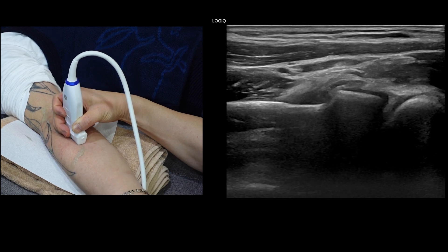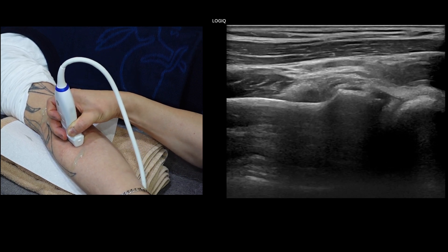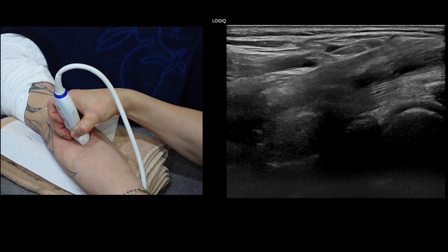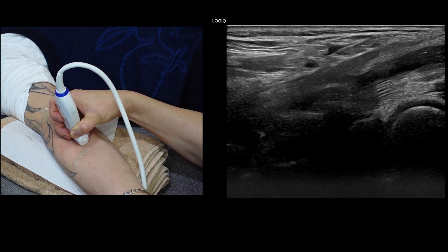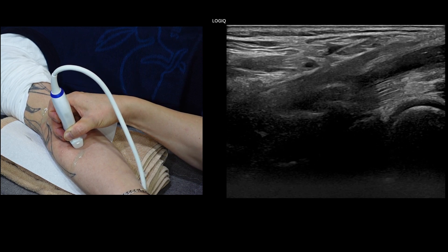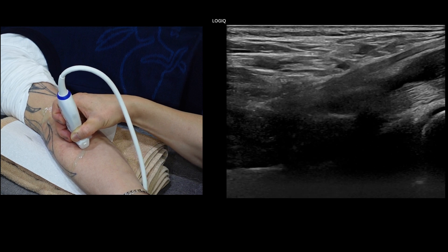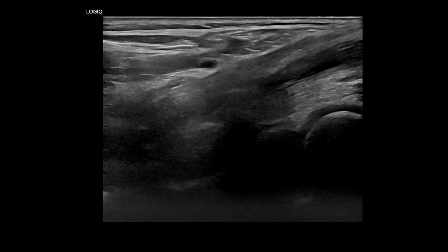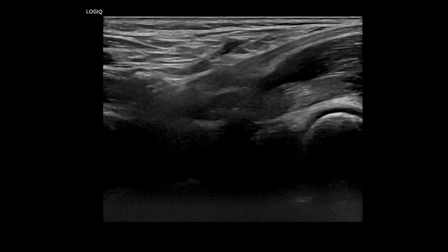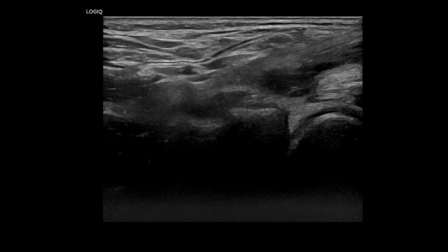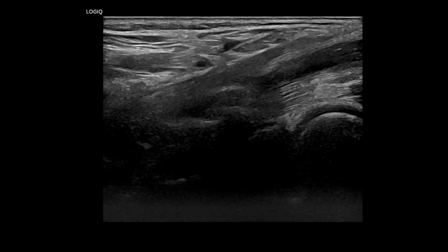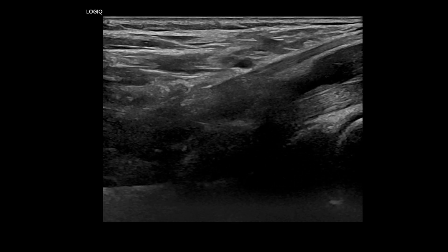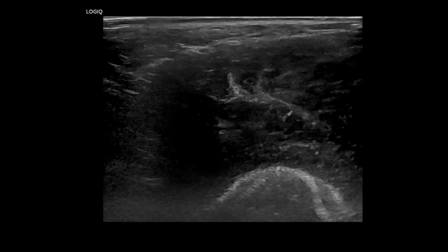If the patient reports pain while lifting objects with the forearm or experiences pain in the anterior elbow, we will include an evaluation for biceps pathology. Typically, the biceps tendon is examined using only a longitudinal scan. However, we will also check with a transverse scan, particularly if there is any indication of pathology, effusion, or need for an injection procedure after the examination.